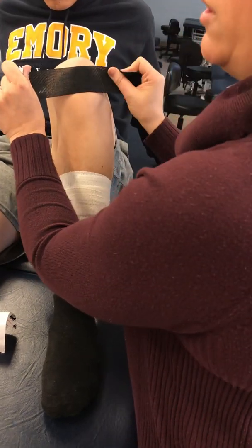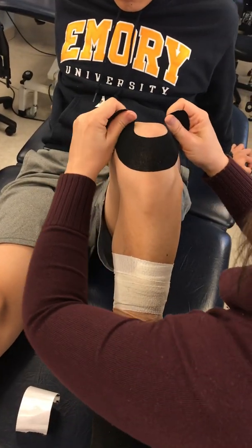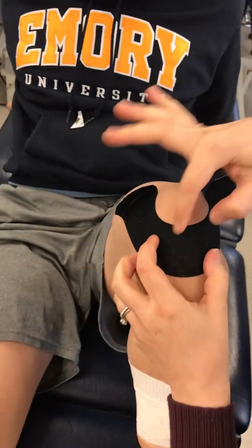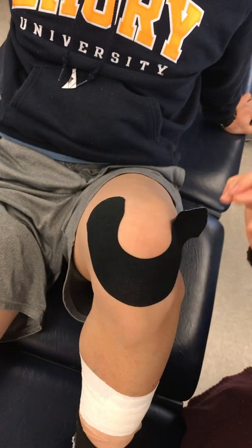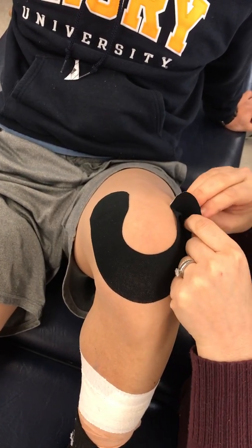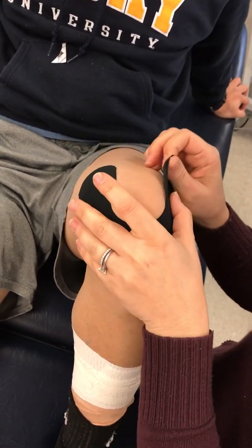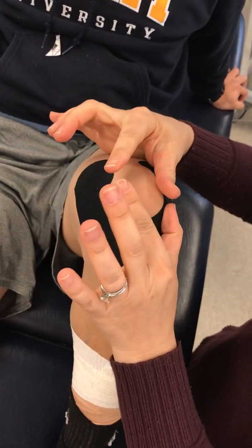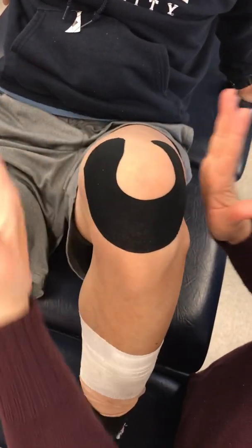The inferior pole of the patella is there too, okay? And we're going to come around, enveloping the patella, okay? And then we're going to just lay down our edges in the direction, because what's the big thing we want to be focused on with the knee? Medial glide of the patella. The tracking, right? The overall tracking. Typically, yes, it might go medially, it might do a little lateral tilt depending on how much tone is from the VL and the VM, right? If there's an imbalance here. But essentially we want it to track properly.